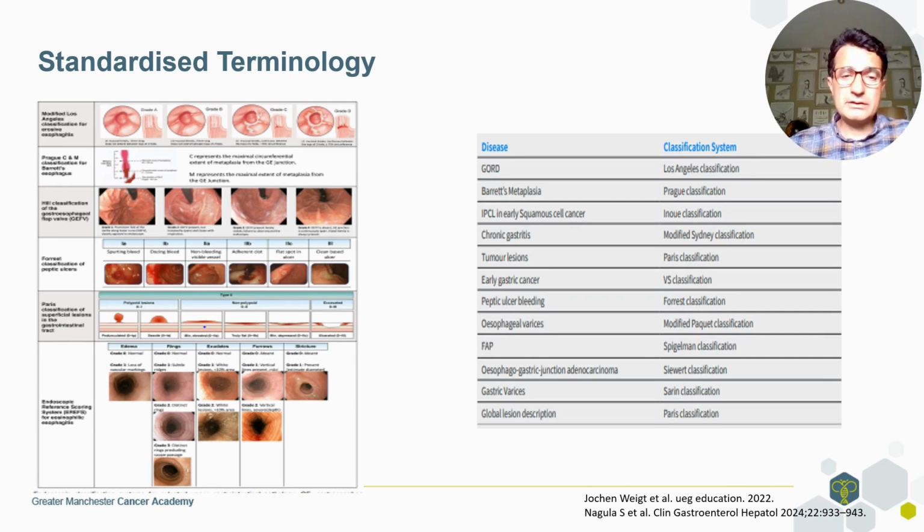EREFS classification for eosinophilic esophagitis, I find it quite useful as well.